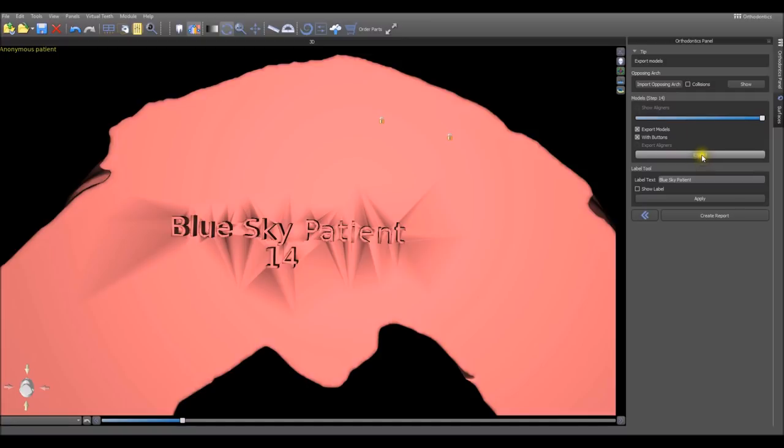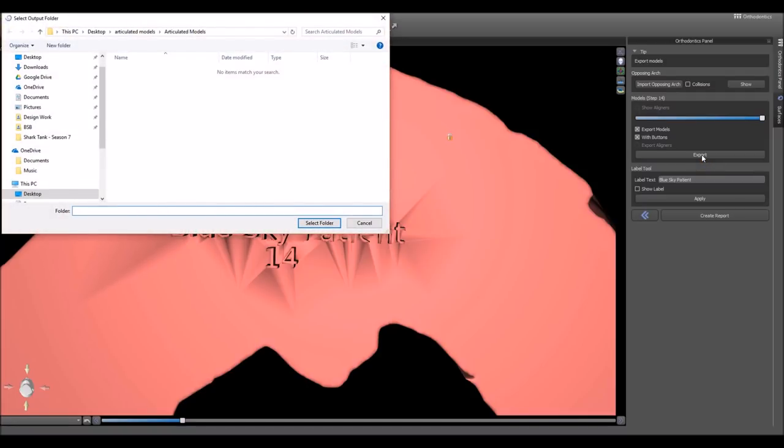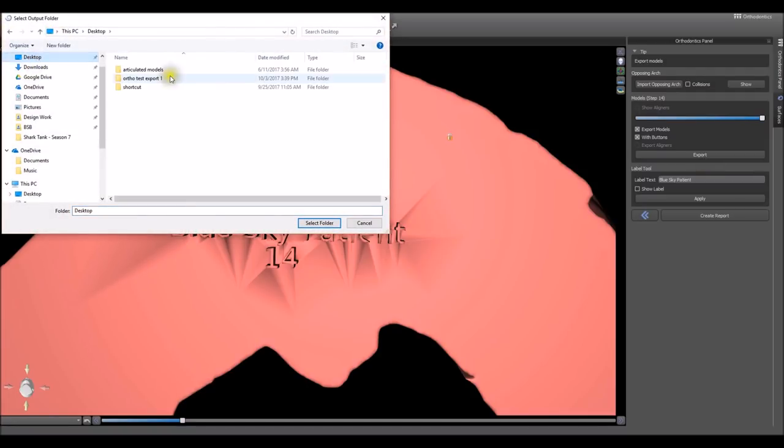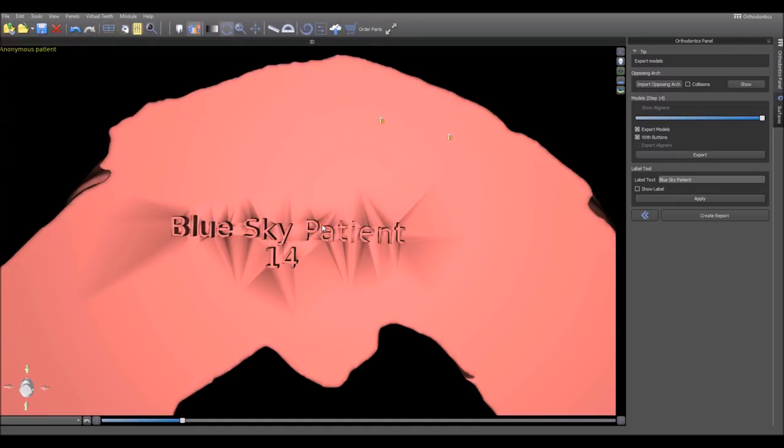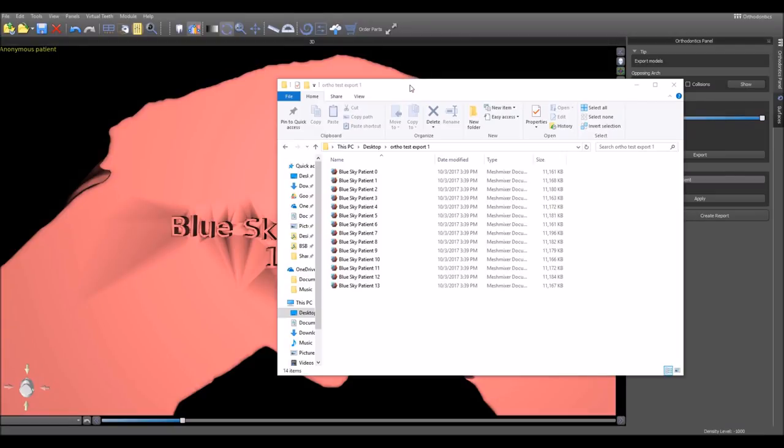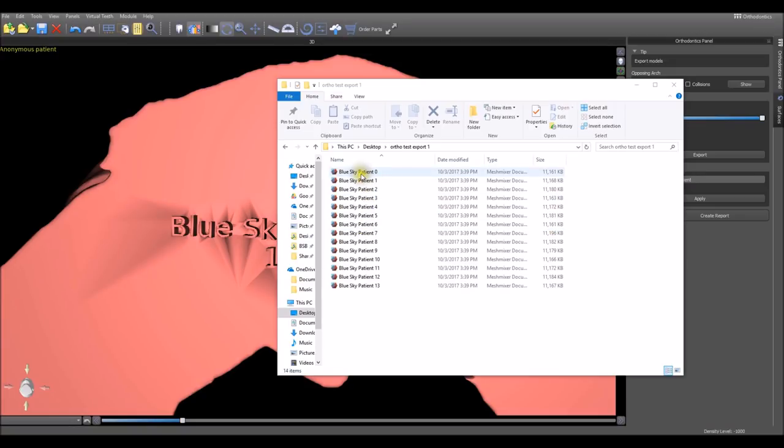Once we're done, we can press the export button. We navigate to the location where we want to save it. We're going to put it into this test folder and press select folder. We can see that the software has exported all of our different models. If we had designed the aligners as well, then for each step we'd have the model and the aligner appearing here in our export folder.